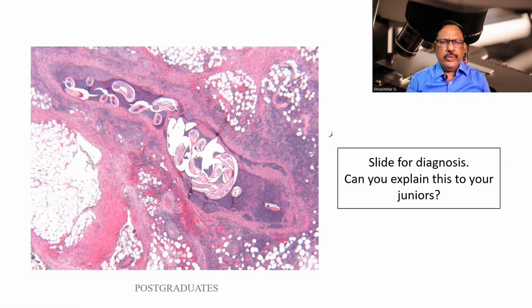What is your diagnosis? Can it be an Enterobius? Why not?